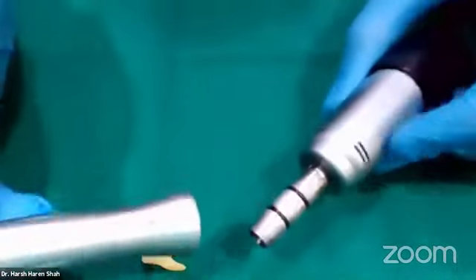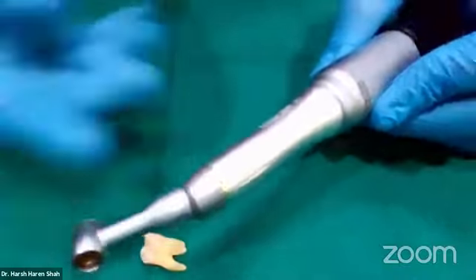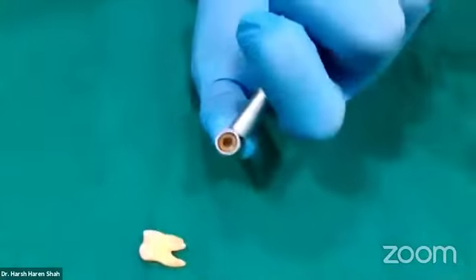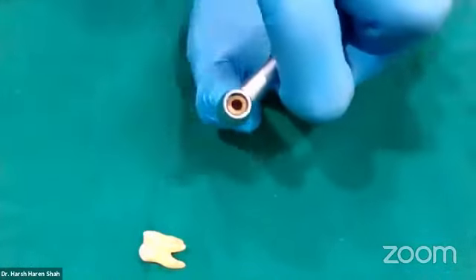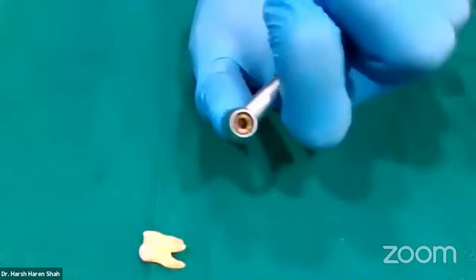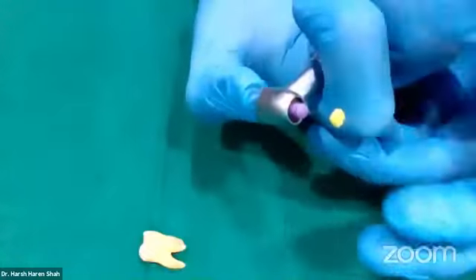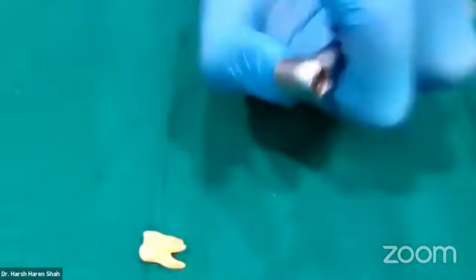As you can see, I'm just connecting it to my micromotor here. I'm not connecting a file into this. You can see this is the holder where the K file is supposed to go. When I press it, it opens up. This is open, this is closed. Whenever it is open, it's very simple. I press the button, I open it, I can just insert a file. This might be slightly difficult because I told you that you're supposed to be doing this once your file is inside the tooth. So let's see how that works.